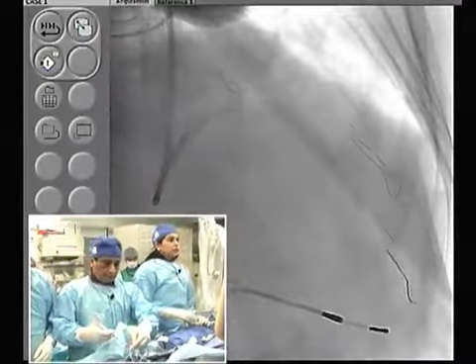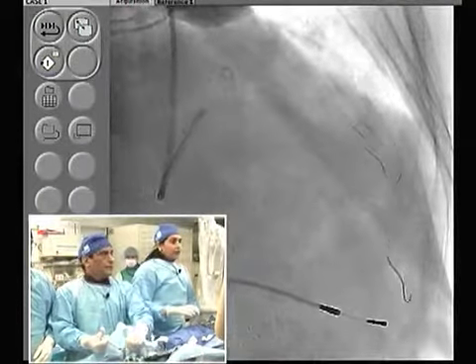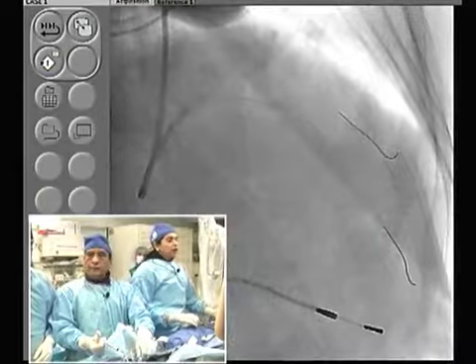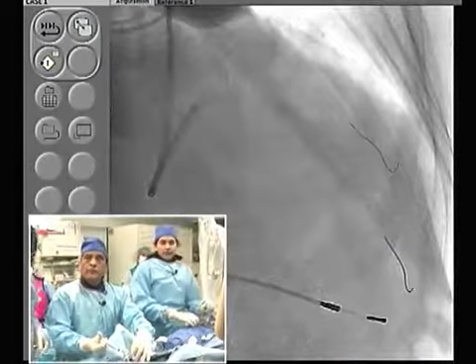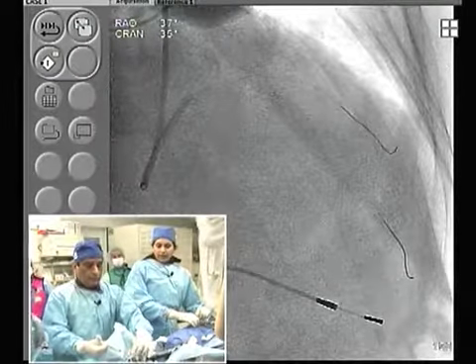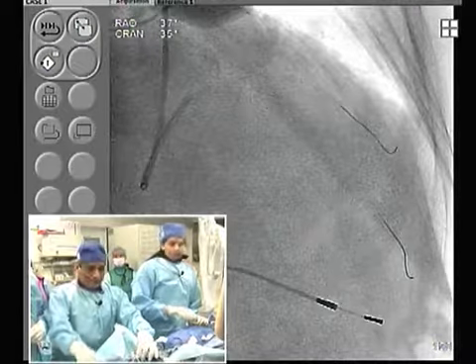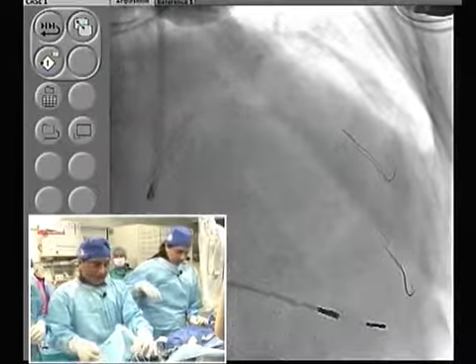Excellent. Good diagonal. And same, pull back to the guide, reorient it so that your blades will change, and then went back and did the cutting. So we did a total cutting of the ostium 3 times, up to 8 atmospheres. Well, 15 years ago, that's how we used to do DCA. Right. Yep, that's exactly correct.